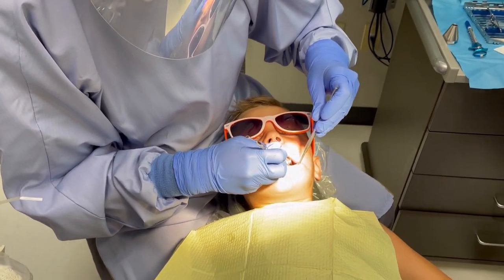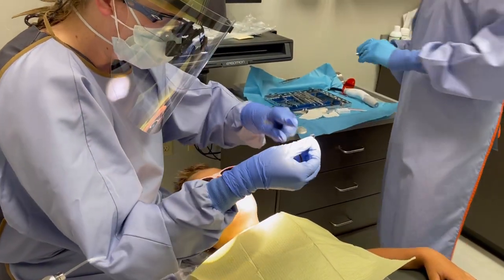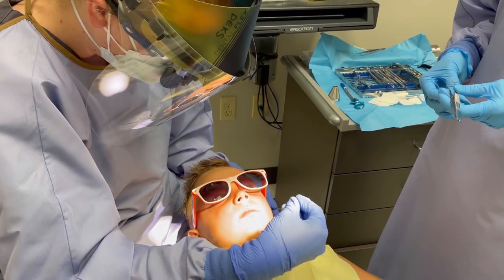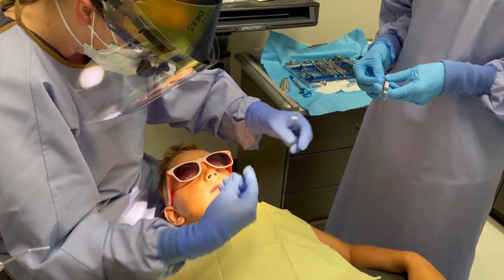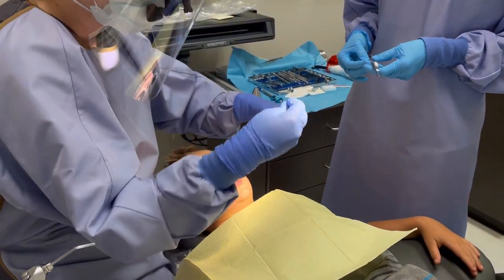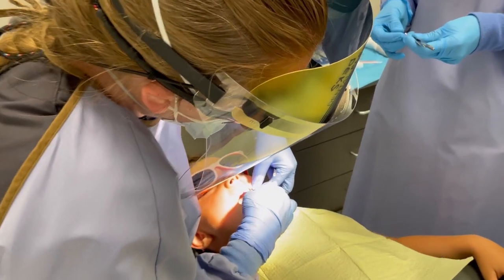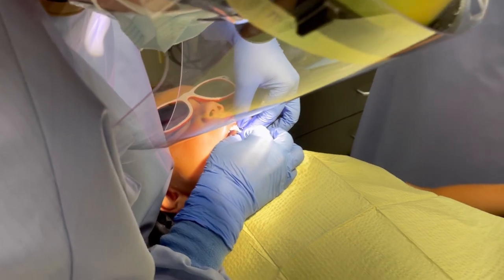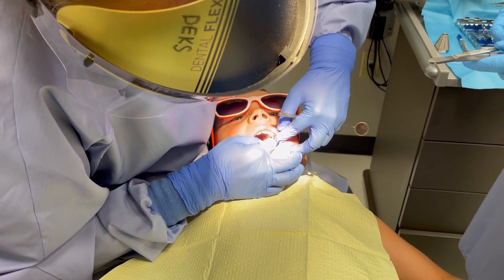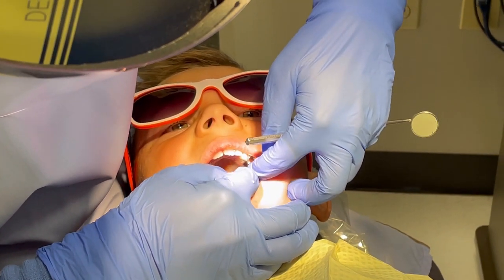To do this filling, I want to make sure that we don't stick your teeth together. So what we do is we have a little ring that goes around your tooth — just like a little ring that would go around your finger — and it just goes right around your tooth to help prevent your teeth from getting stuck together. You're just going to feel a little pressure, kind of like when you put a ring around your finger. So we're going to put this ring around your tooth, then do that tooth shampoo, get it all cleaned out, and put the filling in. We still want you to be able to floss.